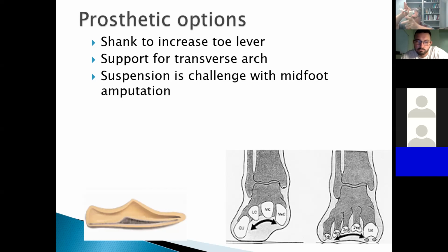Let me show you a little more closely. If this is removed, or even a little bit more is removed, then there is just not very much to keep something shaped like a shoe on what is left of the foot.